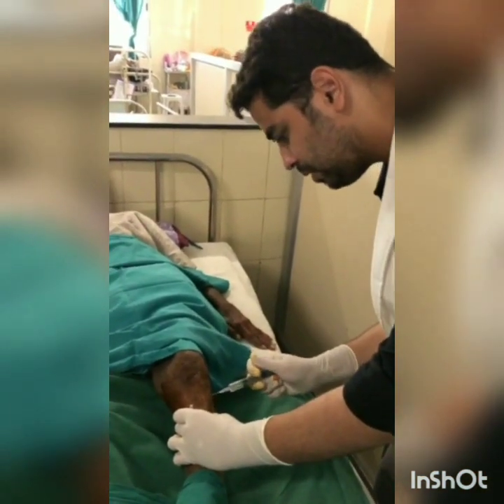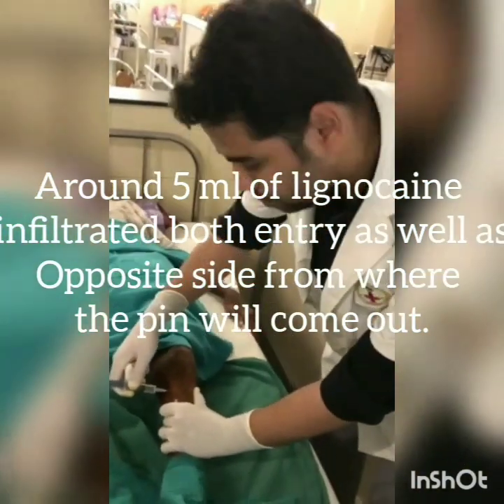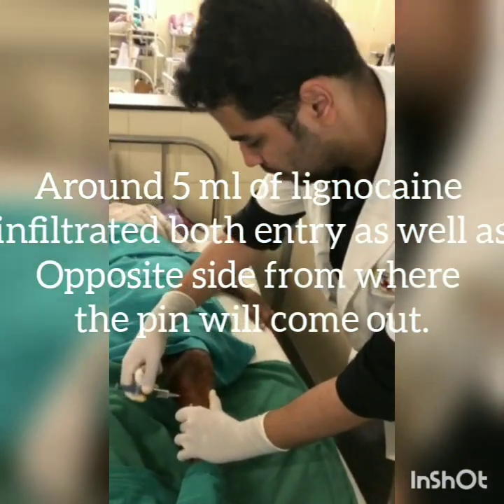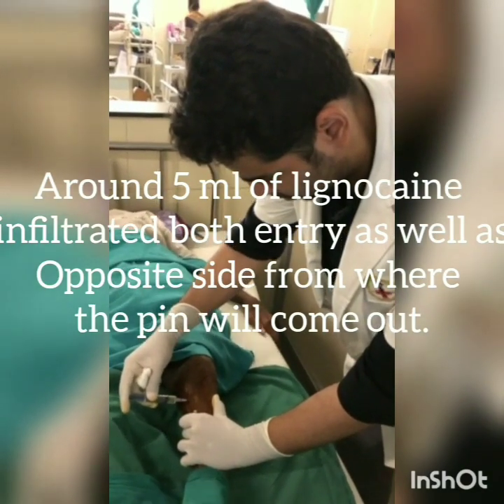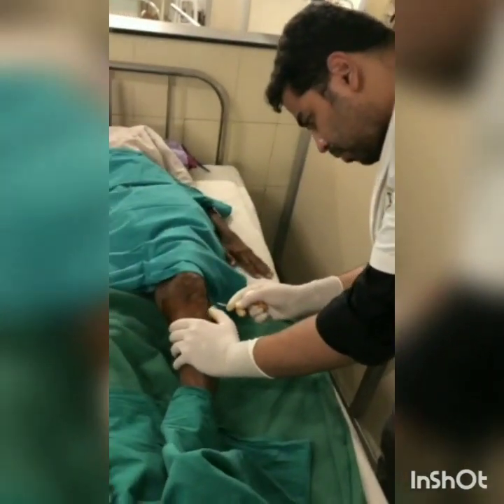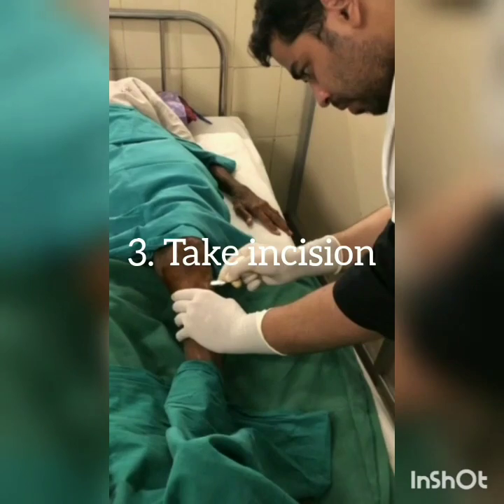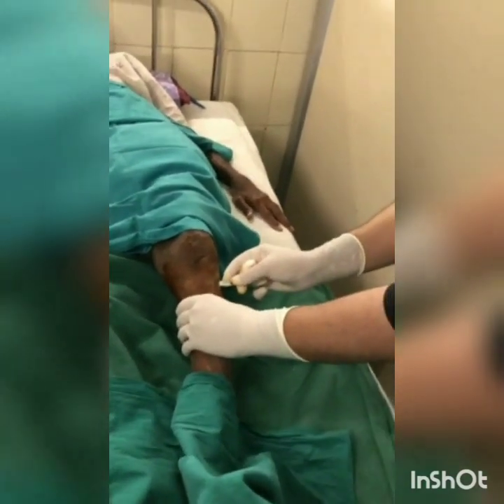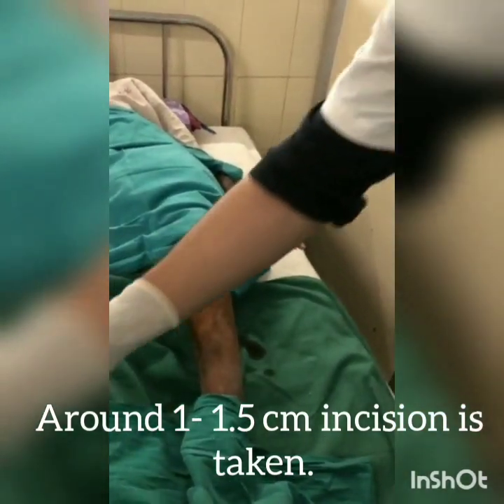Around 5 ml of lignocaine is infiltrated. The local anesthetic is to be infiltrated on the opposite side from where the pin will come out. We have to take an incision from the entry point — around 1 to 1.5 cm incision should be taken.